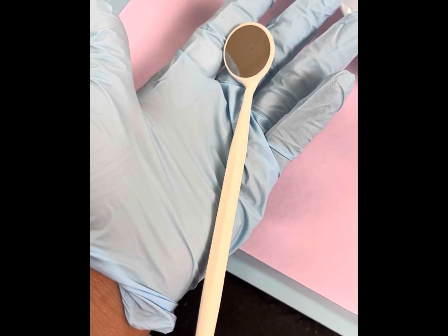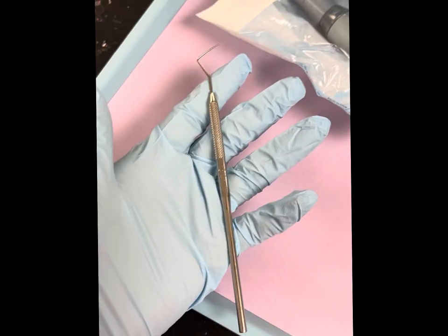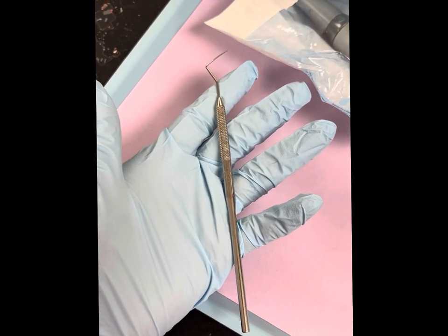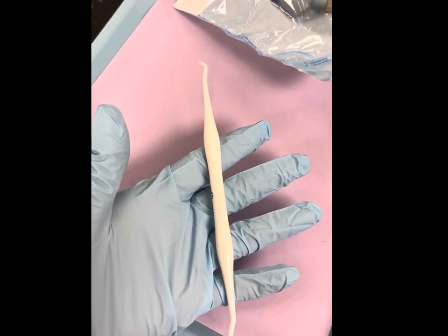You will always start off with the basic setup, which will be the mirror used for visual. This is the explorer used to check the occlusal surfaces of the tooth. This will be a probing instrument used to measure the depth of the tooth pocket. This is a plastic composite instrument used to shape and remove excess filling materials from a tooth.